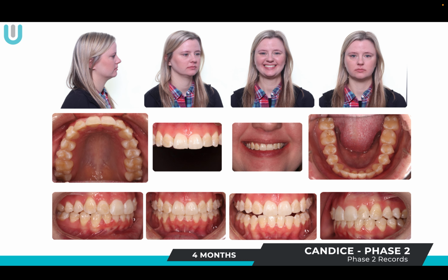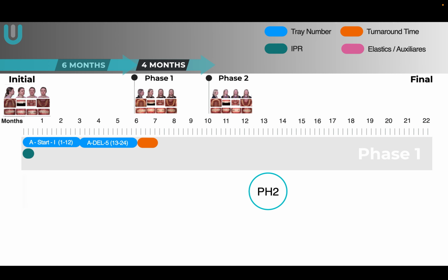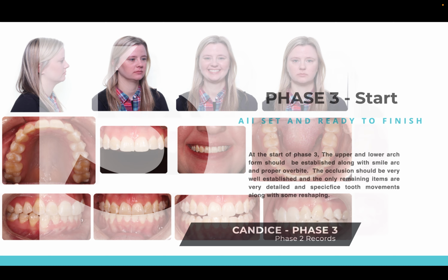But if she starts pointing at a lateral being a little higher or a tooth sticking out, let's say that upper left maxillary second bicuspid, it's easy for me to address that now because I have one more round that's included in her treatment. Again, we package this for a reason so the patients know what they're getting and what to expect, so that I don't get in this endless refinement phase, which I used to do.